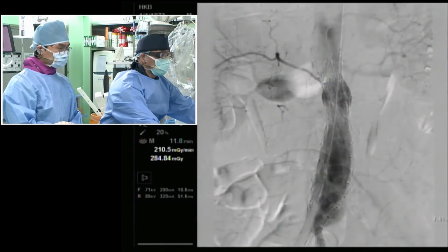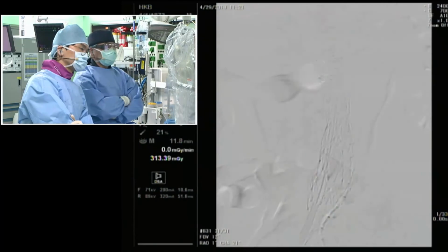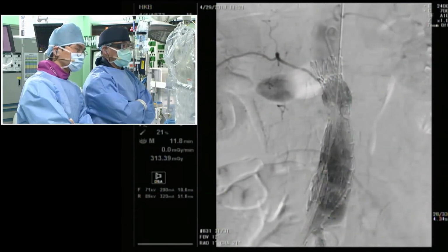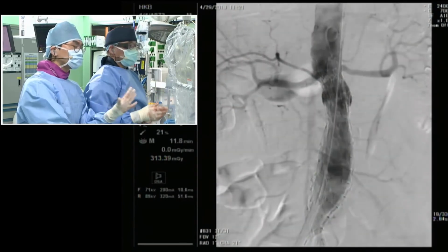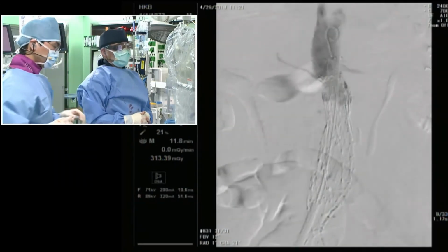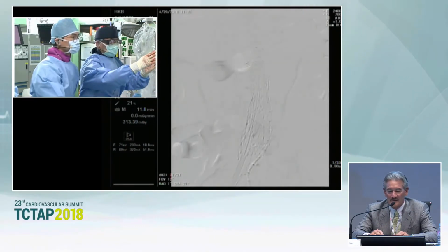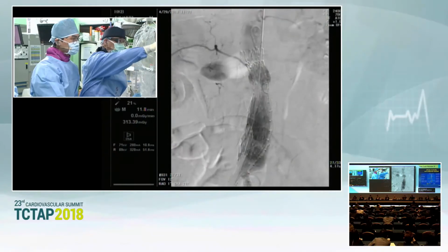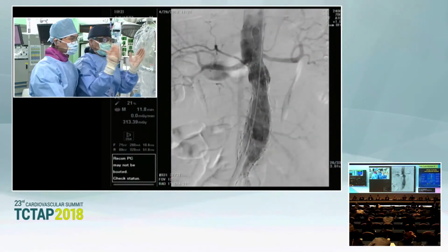Yeah, it looks nice. Looks good. You still have, you know, this will go away, but you can balloon it. You have a little leak around where it's bulbous in the neck, but you have a minimal one showing up in the distal sac. I'm sure as you balloon it or fully expand it, it should be okay. I mean, you see the space filled with contrast just at the level below the renal artery. It is not an endoleak, but it is still within the graft.